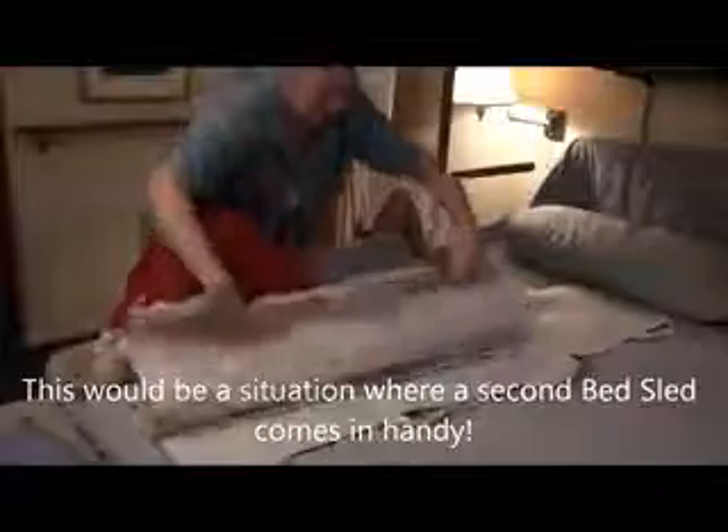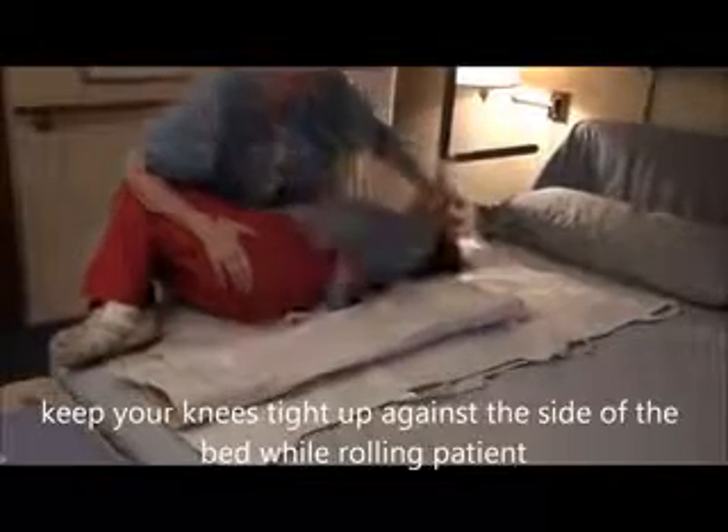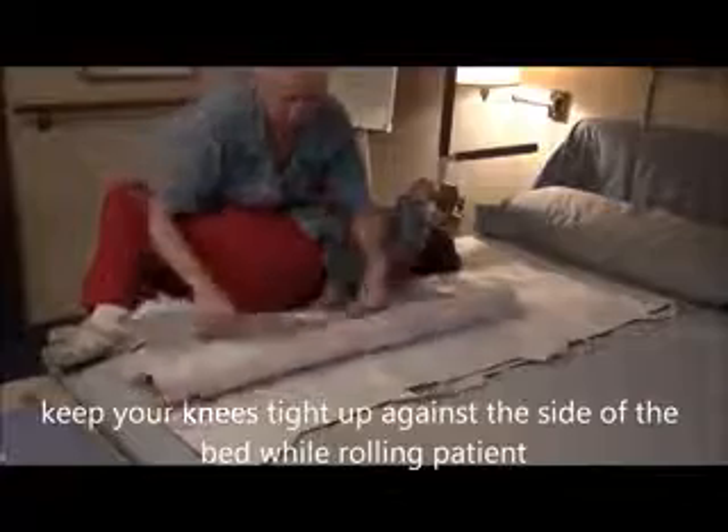So I have the bed sled here. I'm going to fan fold it. I'm going to roll her towards me a little bit, standing close to the bed so she doesn't fall off, bringing this close underneath her. I'm going to roll her back on top all the way across. Pull the bed sled flat, and now she can lay flat. From this position, get the handle out of the way. Put your arms down.